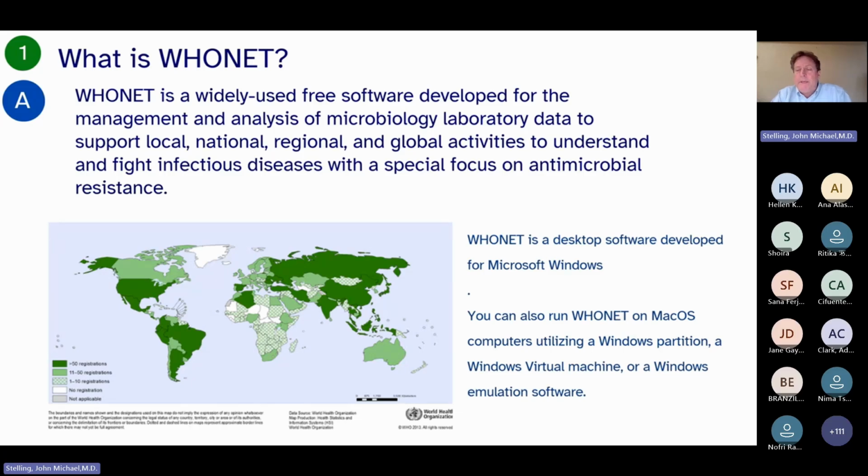WHONET is a desktop application developed for Microsoft Windows. Many people do run WHONET very well on Macintosh computers, either with a Windows partition, a virtual machine, or an emulation software. If you would like further information on that, we have information, I believe, on the website, or just send us an email and let us know. So that's what WHONET is.